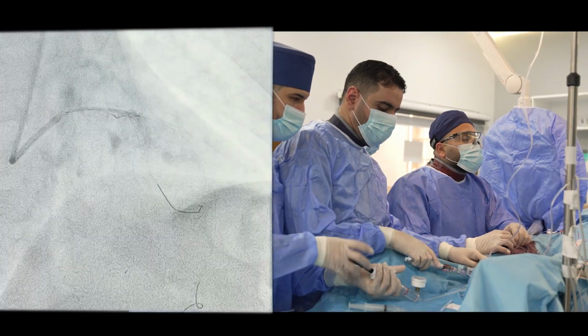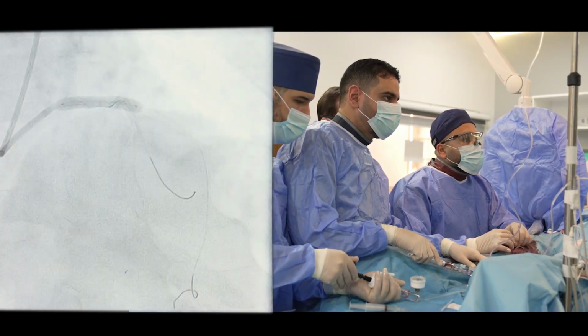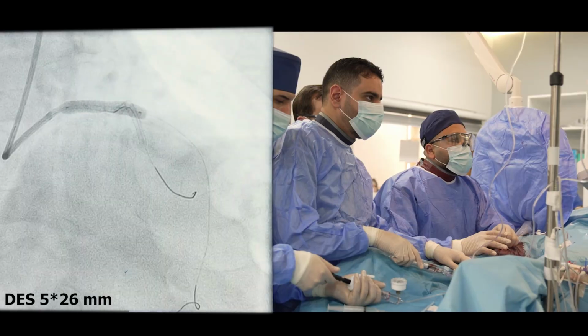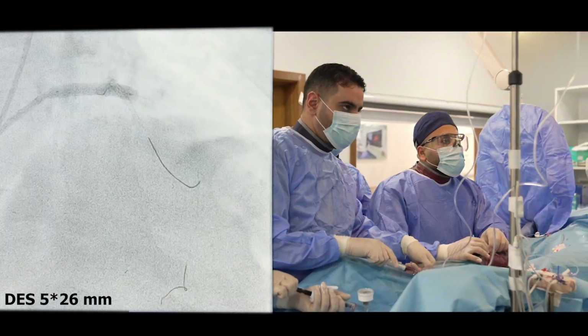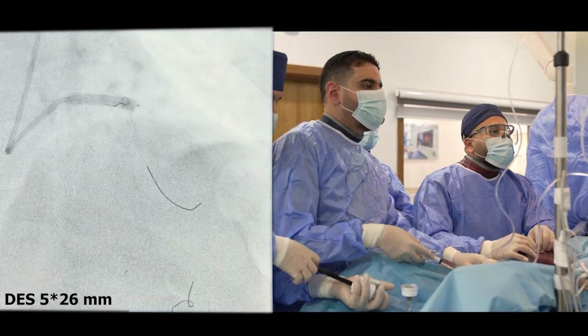Inflate. Nominal is good. 12. Go 12. Stop. Perfect inflation. Off.